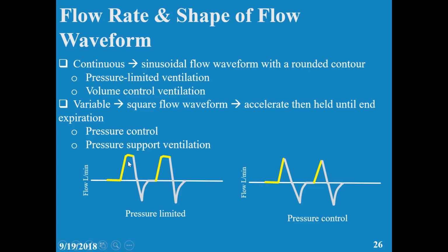Anyhow, when you have a hold in the flow, that means volume. And it's very clear that you can see this shape is different from this shape. However, you can see that in this way, the exhalation goes right away to the inhalation, going right away to exhalation. So there is no pause in between, the first. And second, the in is more than the out. And why is the in more than the out here? There is leaking. No, there is no leak here. Because we want to achieve the volume. Once the desired volume is achieved, they will become the same.